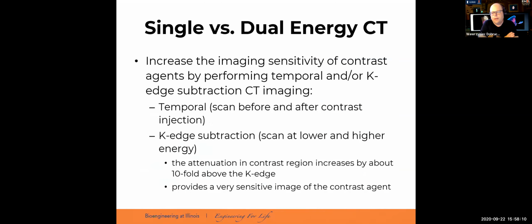what we can actually do is so-called dual energy CT. This is an advancement, a new feature of the X-ray CT systems, which were introduced not long ago. It's probably within the last 10 years that it came to be used in clinical imaging. So we can image the same material using two different energies, one before this K-edge jump of the attenuation, and one after.